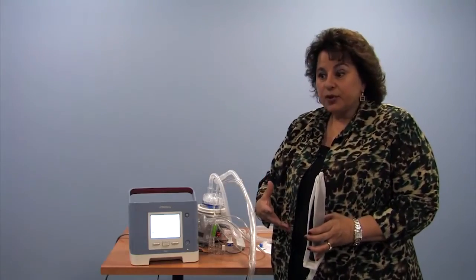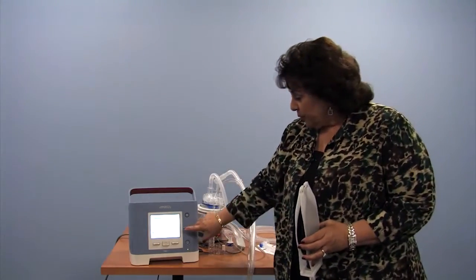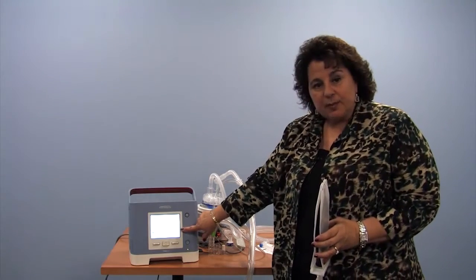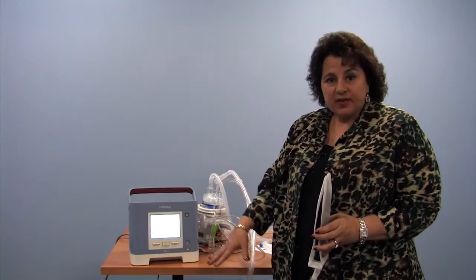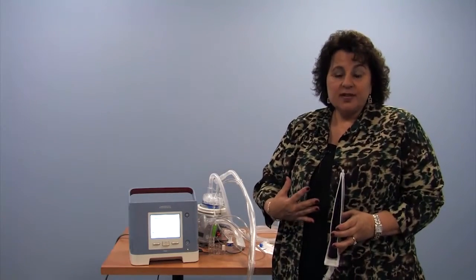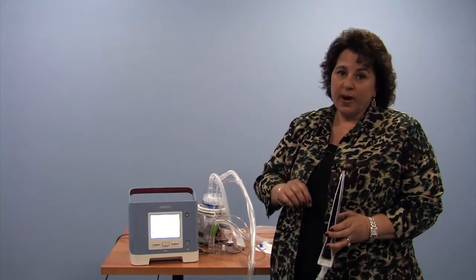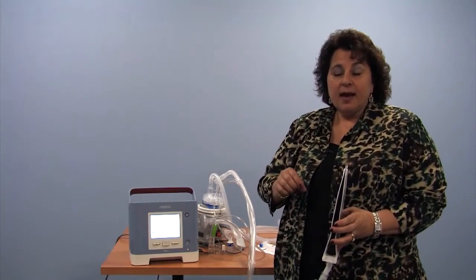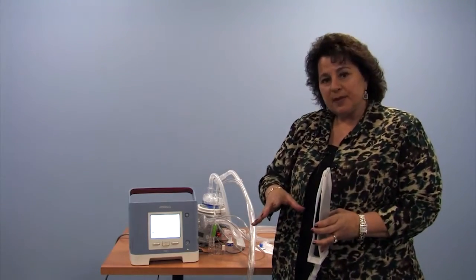So when children are up and awake and watching TV, stimulated by therapists and whatnot, they tend to breathe faster. So if you watch, the minute ventilation number may be higher when your child's awake and active versus when they're asleep and relaxed. I always ask parents and caregivers I work with to please know your child's breathing rate and heart rate, awake and asleep. That will help guide you as to when they're well and maybe when something's not quite right.